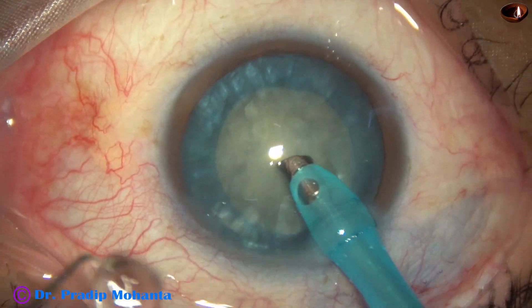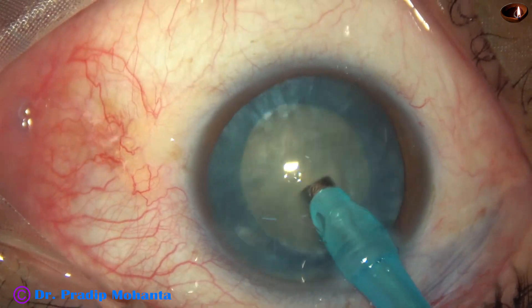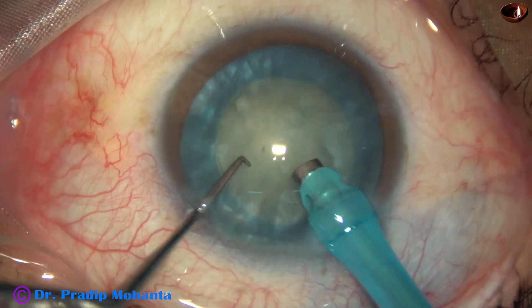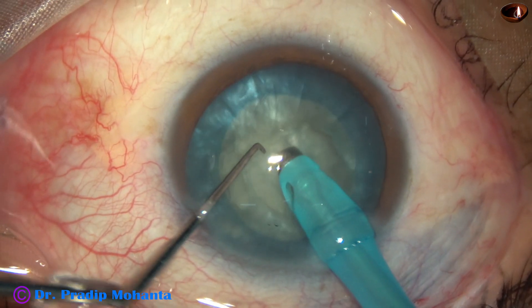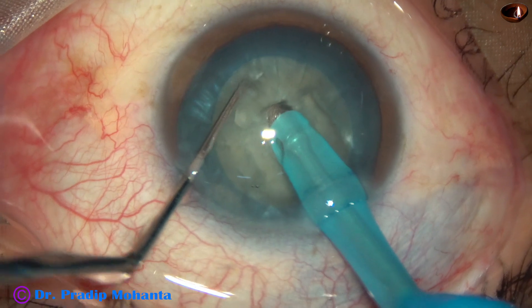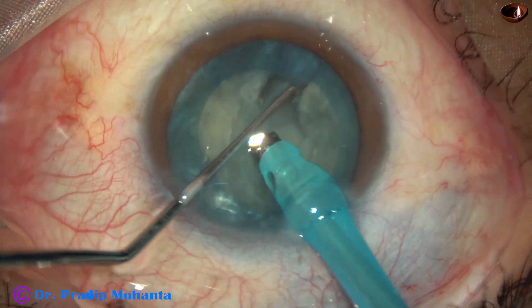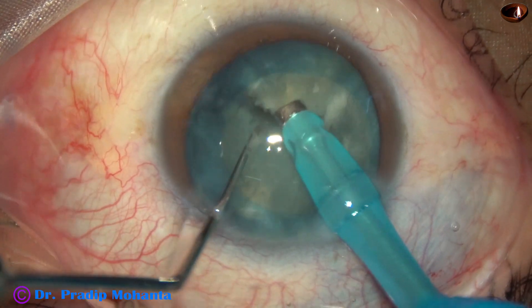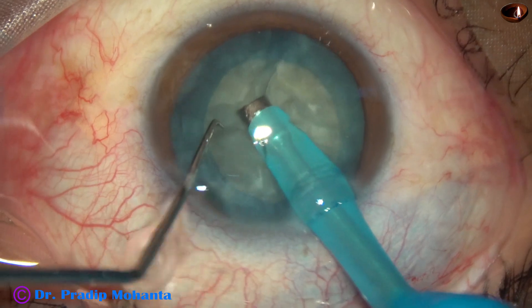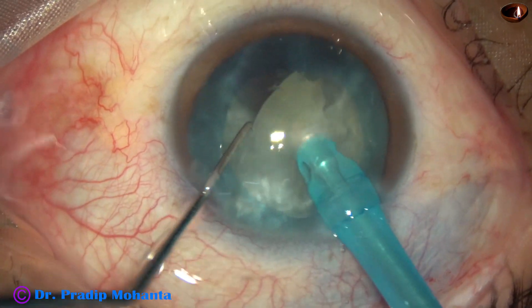Let us see how we can divide this nucleus into several fragments. The tip is buried into the substance of the nucleus. The nucleus is held very firmly, and this is the first crack. I rotate the nucleus. This semi-nucleus is chopped into pieces, and the pieces are emulsified.